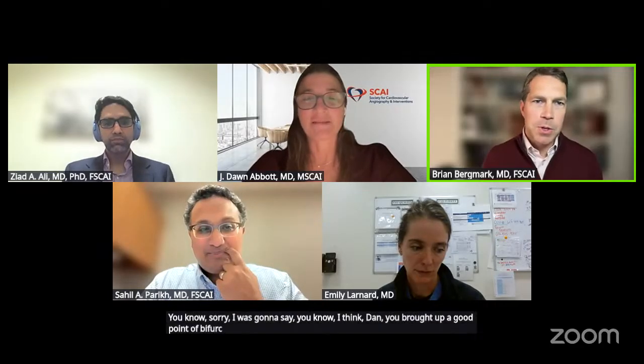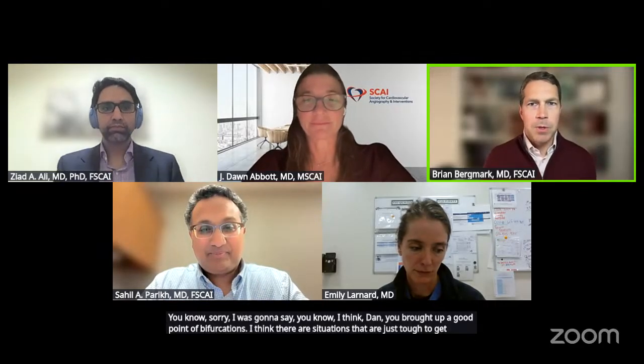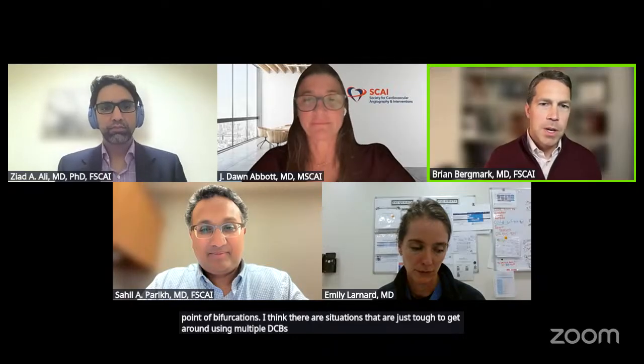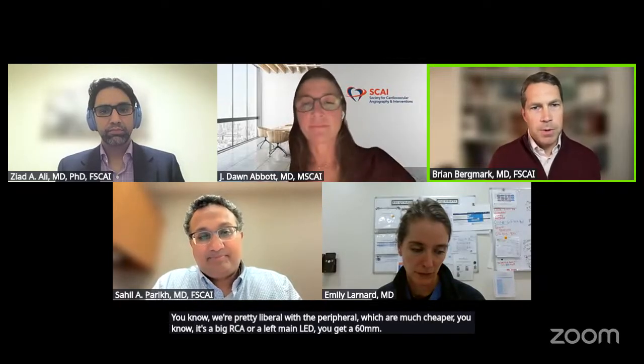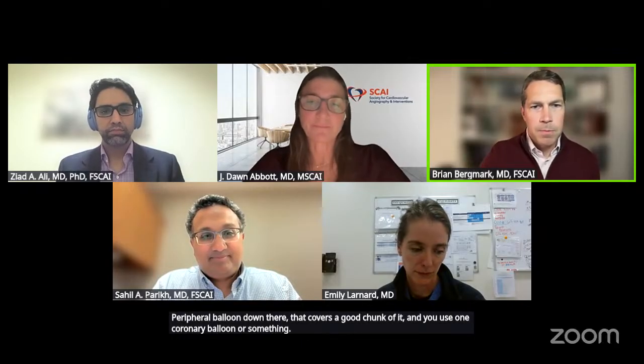Brian, go for it. I was going to say, Don, you brought up the good point of bifurcations. I think there are situations that are just tough to get around using multiple DCBs or coronary DCBs. We're pretty liberal with the peripheral, which are much cheaper. If it's a big RCA or left main LAD, you get a 60 millimeter peripheral balloon down there. That covers a good chunk of it, and you use one coronary balloon or something. I realize that's maybe not something we're supposed to talk about, but.